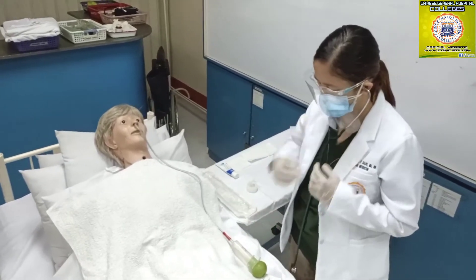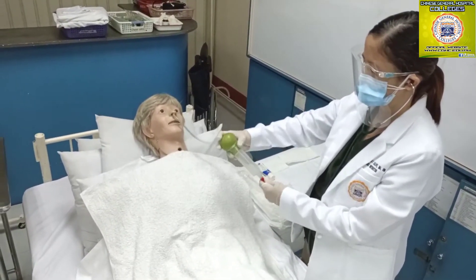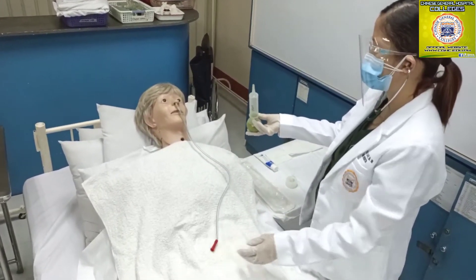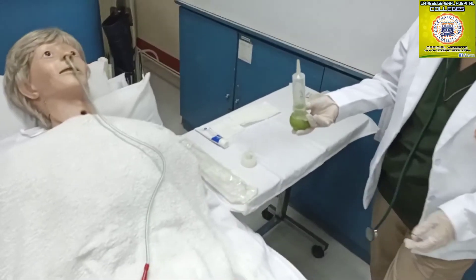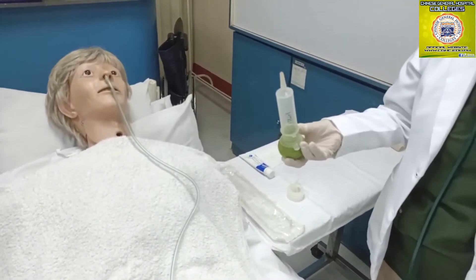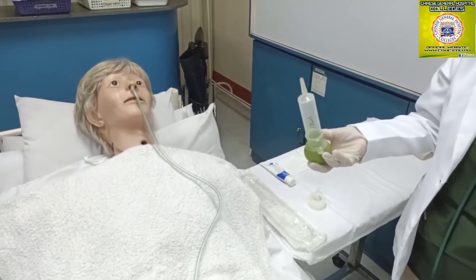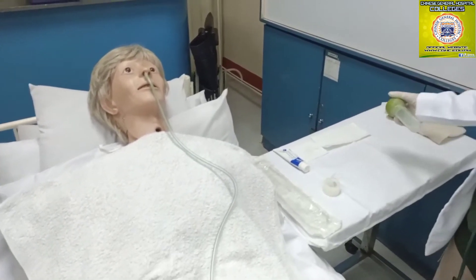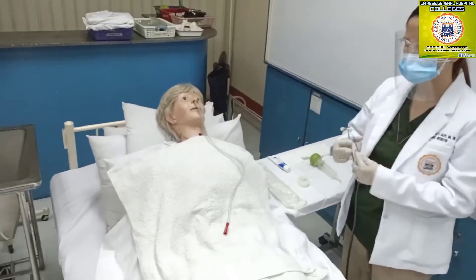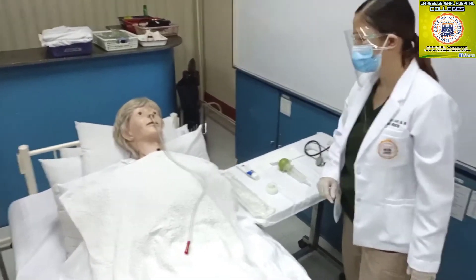You now have your stomach contents. Reinstill the aspirated fluid afterwards, unless the aspirated fluid appears abnormal — for example, bloody or coffee-ground in appearance. Refer any abnormalities and then remove gloves.